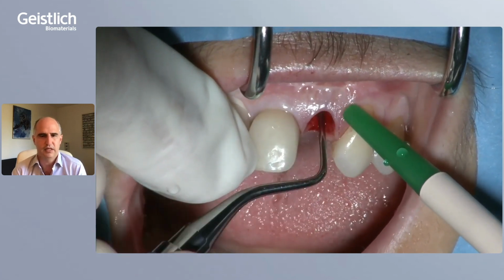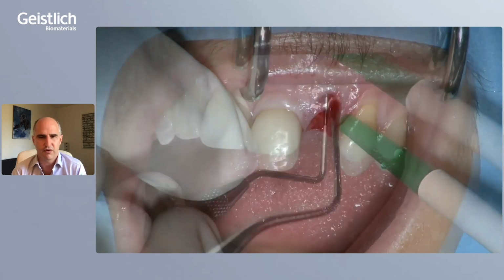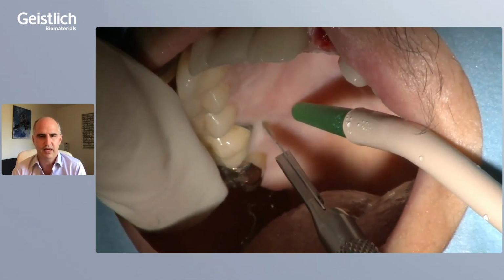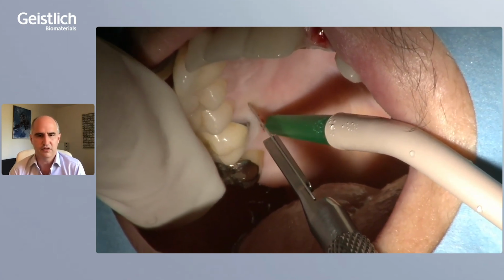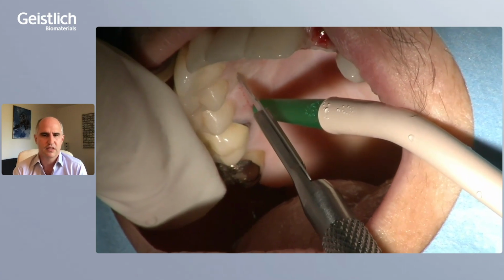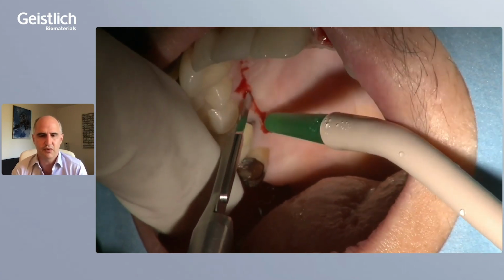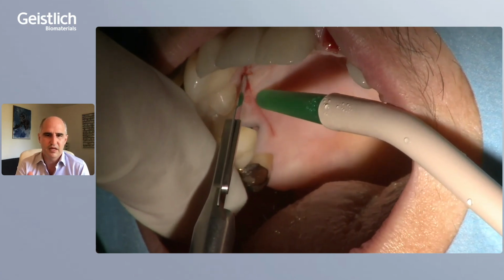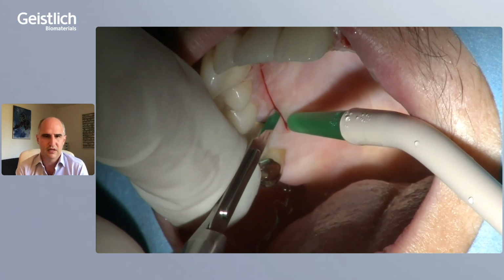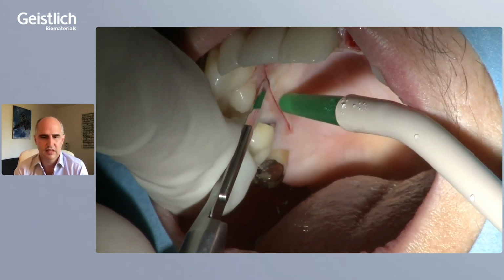So what we did is we tunneled the buccal envelope. First of all, we curetted everything. Here you see the through-and-through defect. And in this case, I think autogenous soft tissue is the gold standard, because we need to prevent the shrinkage, but at the same time, we need to think of an adequate soft tissue thickness and height for the long-term maintenance of this implant, and also for the long-term maintenance of aesthetics in this case.